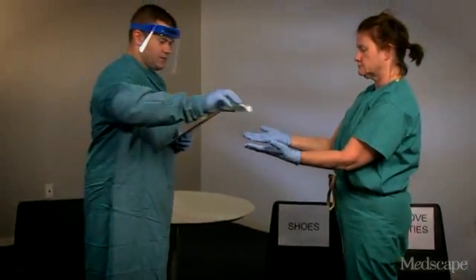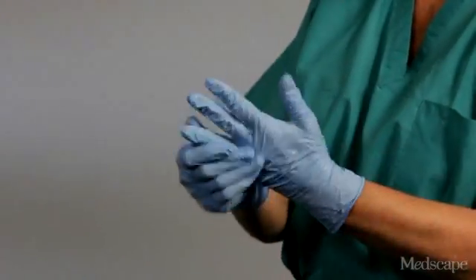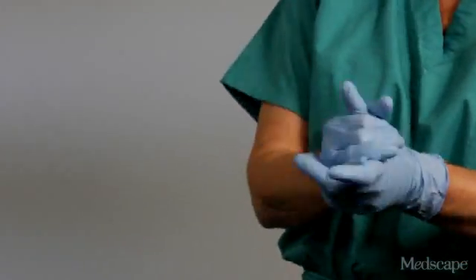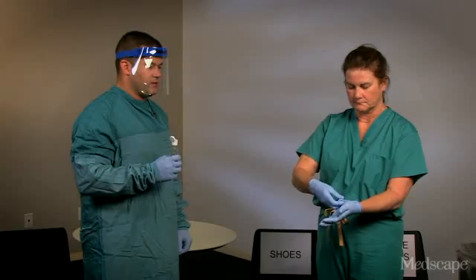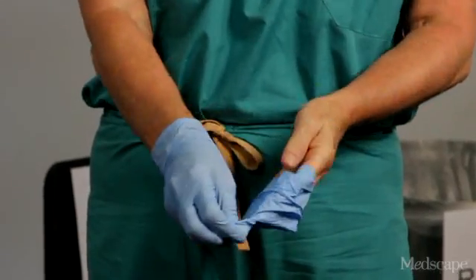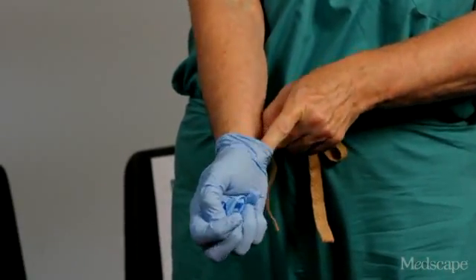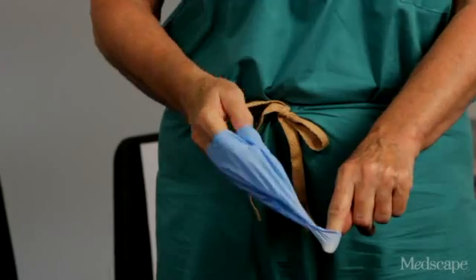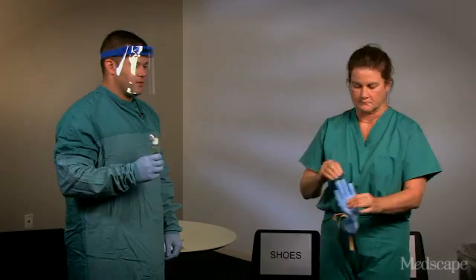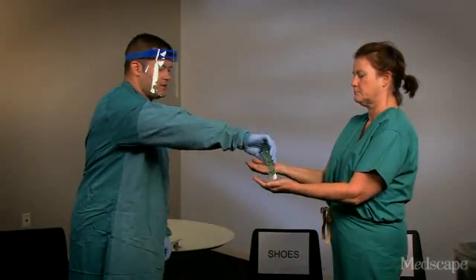Barbara is going to do hand hygiene again with the gloves on. Now Barbara is going to carefully remove her gloves. It is important to note that for the first one she only grabs the outside of the glove and slowly pulls it off. For the next one, while she holds that glove with the gloved hand, she slides her finger underneath the cuff and slowly pulls it off without touching the outside of the glove. Then she will discard the gloves and perform hand hygiene on the bare hands.